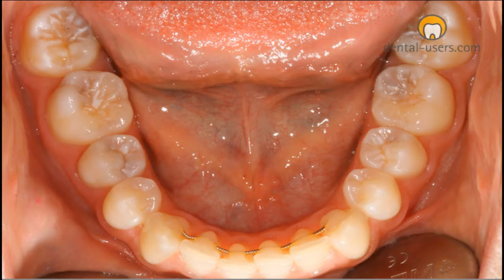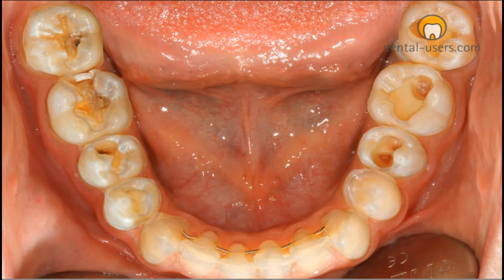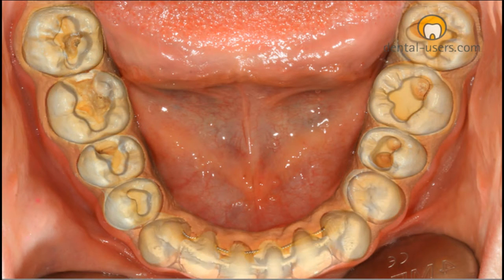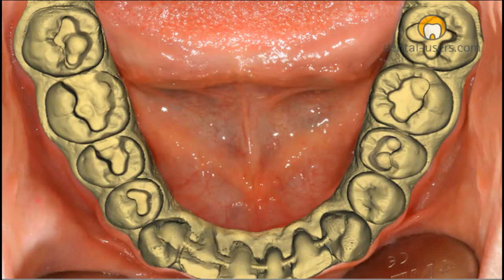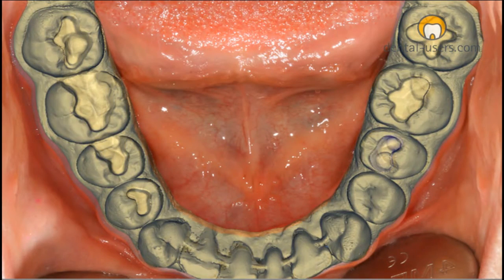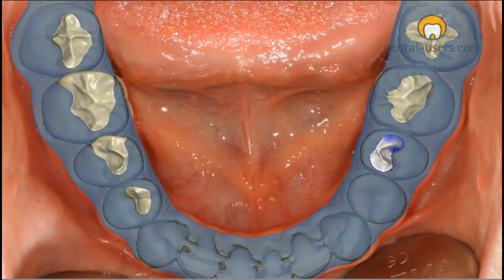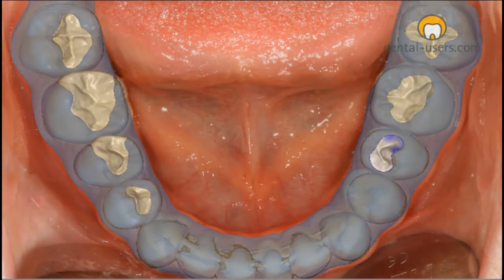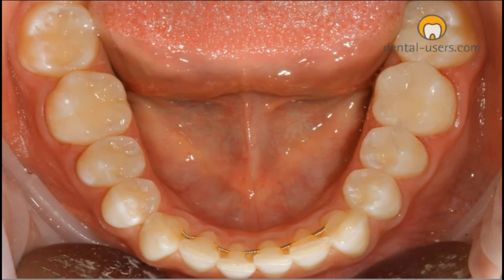The same was done in the lower jaw: the situation before, when the decay was removed, after the scan, the complete construction, and then after fitting.